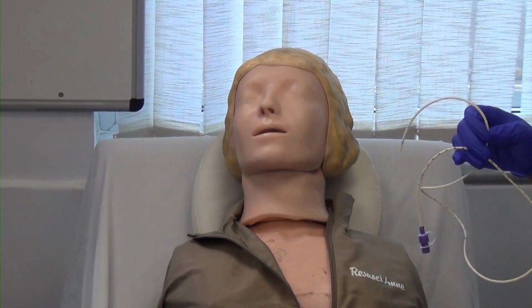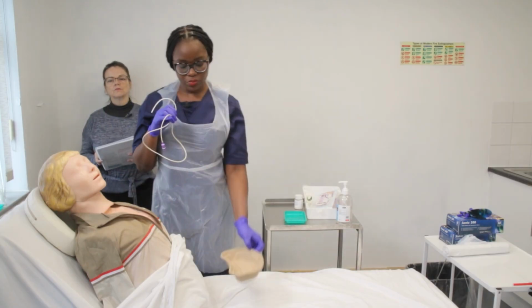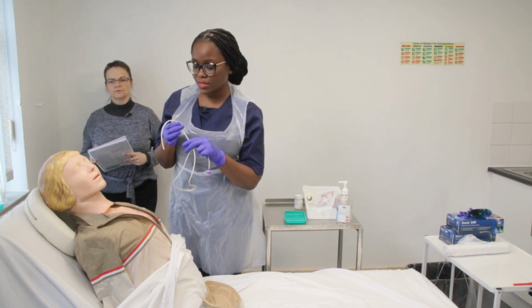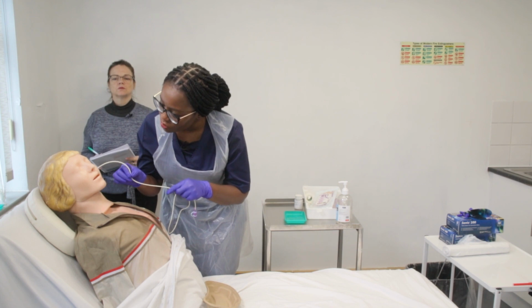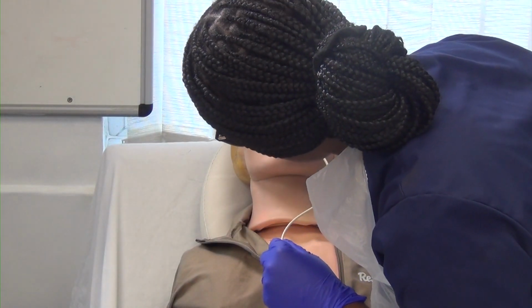Okay, Sue, I'm just about to start the insertion, okay? And this is a disposable receiver tray if you need it, in case you want to vomit or something, all right? Also remember to raise your hands, like I said, if you feel any discomfort or you want me to stop. Sure. All right? So I'm just going to start inserting now till we get to the next measurement.